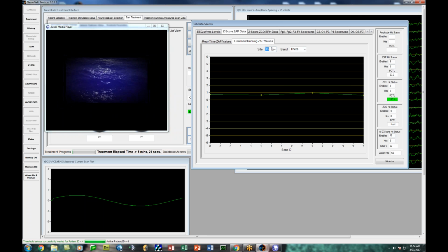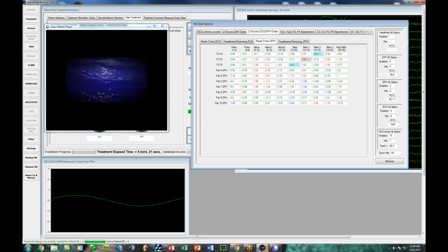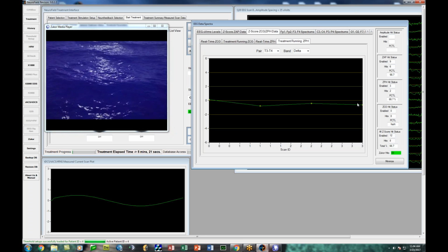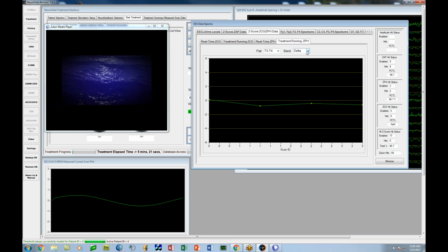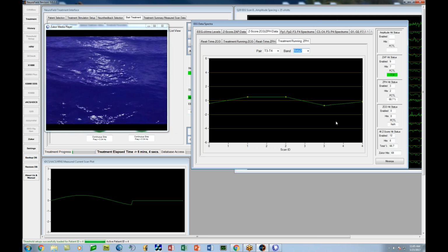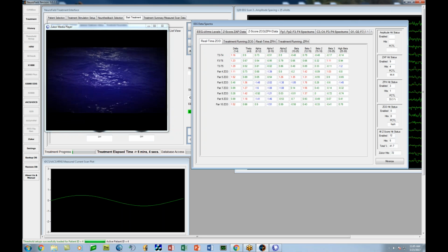The other thing that you can see here is your coherence and phase data. Remember, we set some real-time phase in here, so we can look at the real-time phase and look at the frequency pairs as they're training along. And they were in beta 2. Let's see. There's our beta 2. And you can watch what's happening there. So each one of these is going to plot along. All this data gets saved into history. So it's really nice to see it as you're running, essentially.